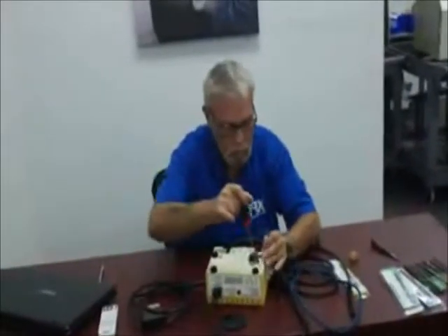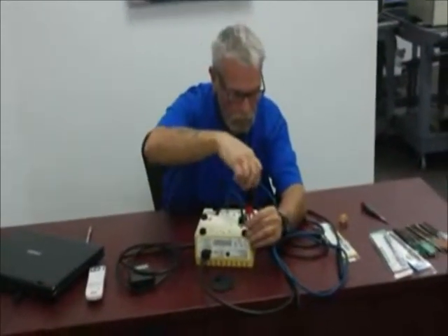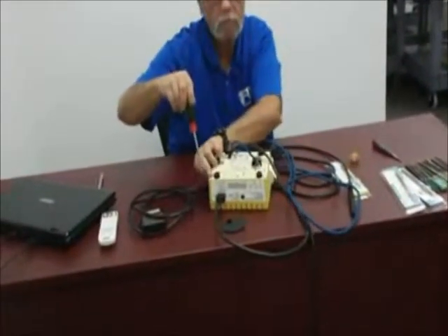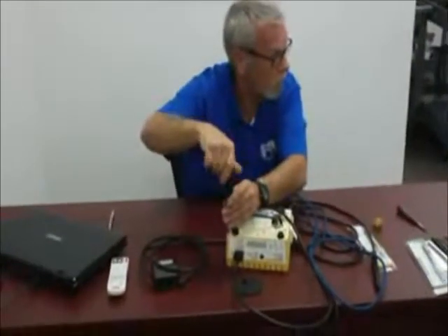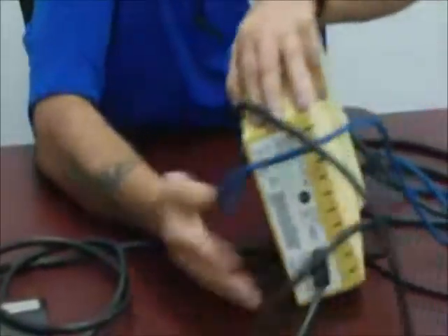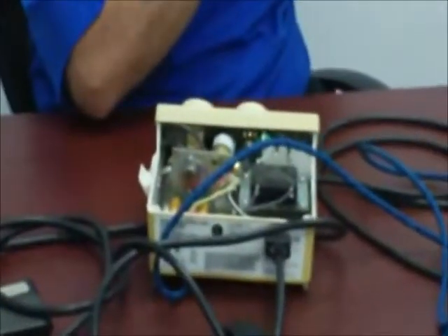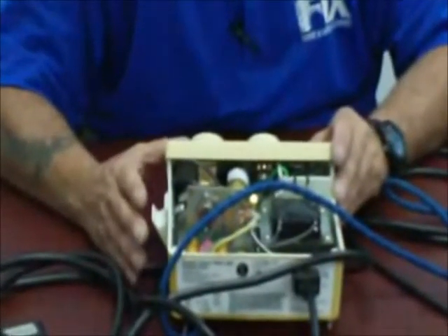Now I'm going to go over briefly how to disassemble the machine. With the machine turned over, some machines have four screws and some have two screws inside the wells — they should be Phillips screws. After you loosen both screws, turn the machine over and the cover lifts right off. By all means, please turn the power off to this machine before taking the cover off.